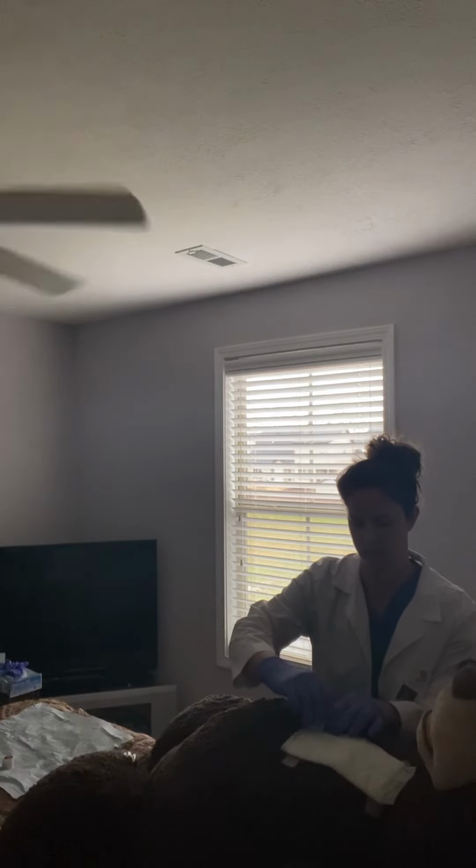All right, so I've got gloves on here, and you always want to make sure that you're considering the patient, making sure that they're not going to get woozy. So you're going to remove the dressing toward them so that they're not going to be seeing it if they get queasy. You're always staying cognizant of the patient. If there's any tenderness with your touching, you want to make note of that, how they're tolerating this procedure. So we're just going to peel away from the skin gently.